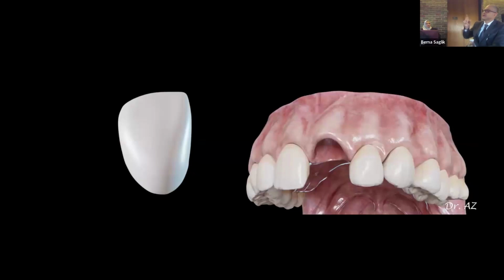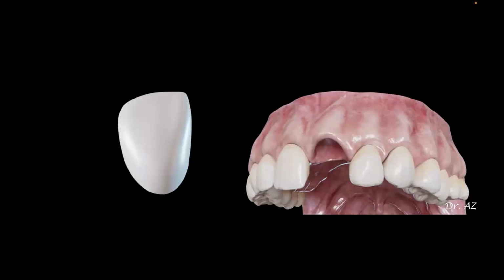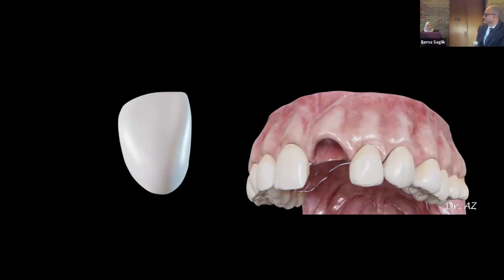Let me tell you an example. If you don't use any metal bar, and you use a fixed detachable, fixed complete denture over 5, 6 implants, pure acrylic, how long do you think that is going to survive? 6 months, a year? Why doesn't your denture fracture every 6 months? Because it's sitting on the gum, which is flexible and absorbs the forces. That's the concept of fixed rather than removable.